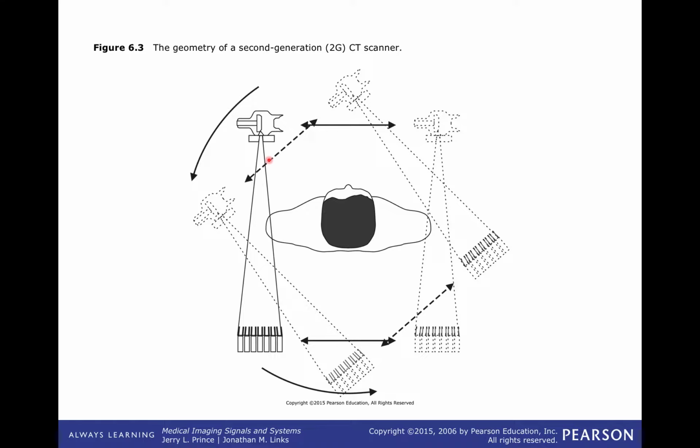You can make this faster, obviously, by making the beam of radiation a little bit broader. You can make it faster by making, instead of a very small, sort of non-powerful source of radiation, you can put it in an X-ray tube there, an X-ray light bulb, make it powerful.